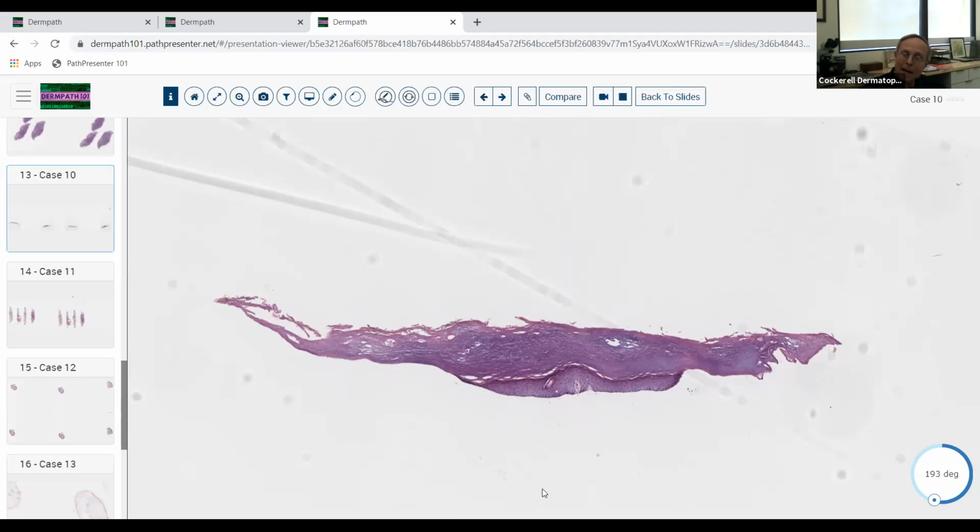So when you're taking a biopsy on volar skin, beware. You really may think you're getting deep, but because the cornified layer occupies so much of the skin surface, you really may not even be getting down into viable epithelium. And that other piece we just looked at over here was only cornified layer. So if you're biopsying a melanocytic lesion, beware of sampling error with a shave biopsy.